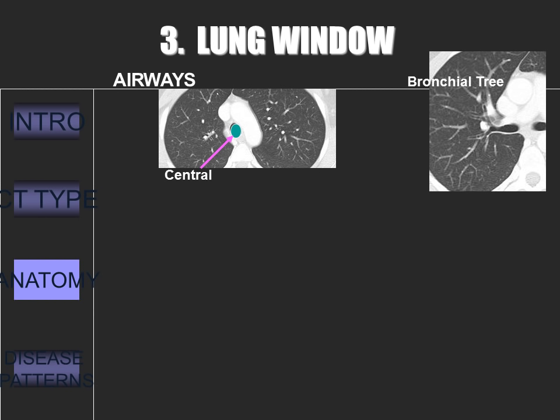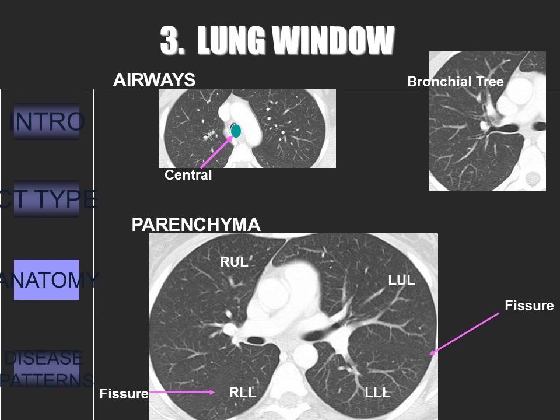Next, we look at the right bronchial tree, and then move to the left side of the bronchial tree. Both times, look for anatomic variants, mucus plugs, and airway collapse. Look to see that the airways do indeed taper.